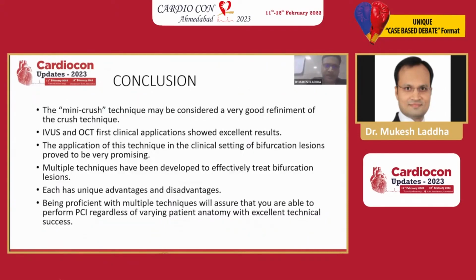Now, conclusion. The mini crush technique may be considered a very good refinement of the crush technique. If I had OCT, I would be happy to do it, or any imaging, but unfortunately that was not there. But really it showed a good result, and excellent results in studies. The application of this technique in the clinical setting of bifurcation lesions proved to be very promising.